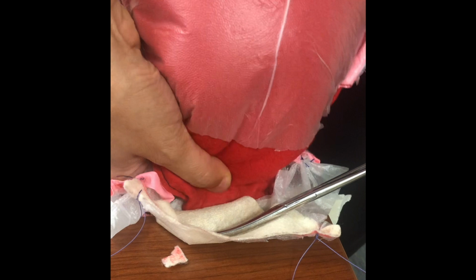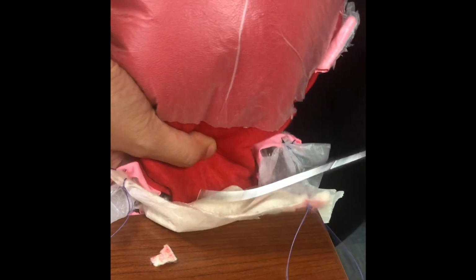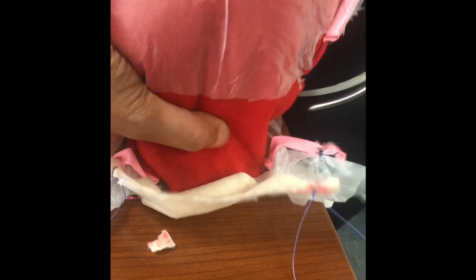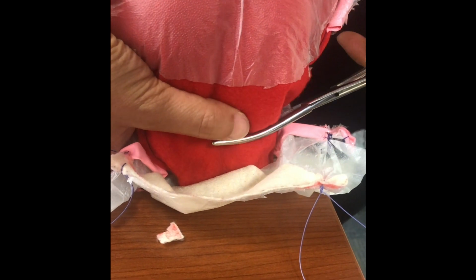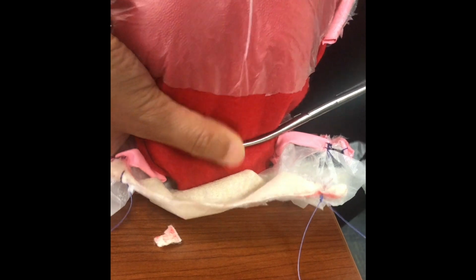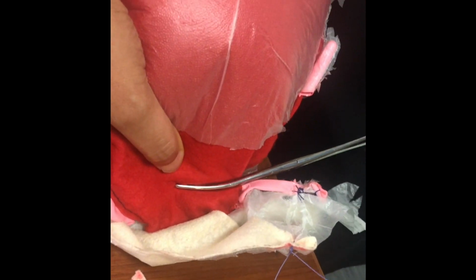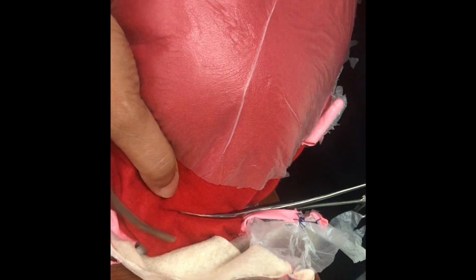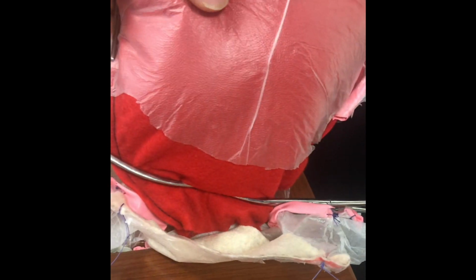After both uterine arteries are divided, proceed to palpate for the cervix. Push the bladder down further at midline, sliding off the cervix. Use curved clamps to clamp down on each side. Then cut the uterus above both clamps.